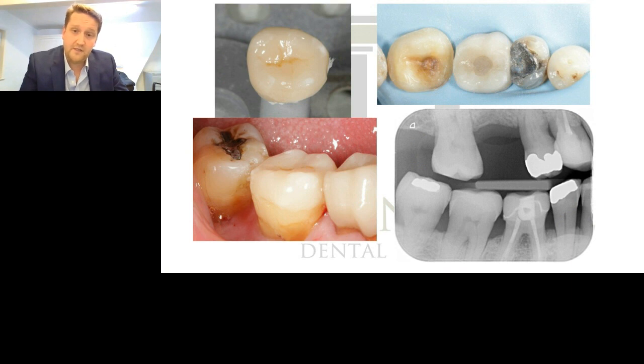This was another same-day case we did, and the reason I put this in is because of the X-ray, really. You can see on here, this is another chairside system, and the thickness of the cement lute on that, and the excess cement that's been squeezed out of the back, is quite significant. Whereas if you have a look at this Emax onlay we did using the Design Studio and the Roland, actually you can't really see the margin or the cement lute. So it just made me realise how well things have come along since this sort of level of milling.